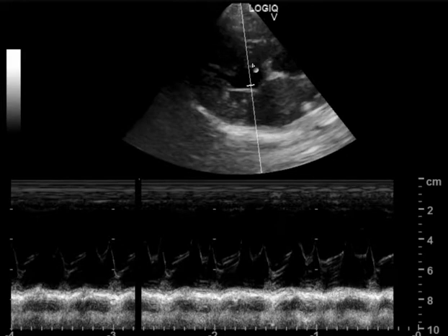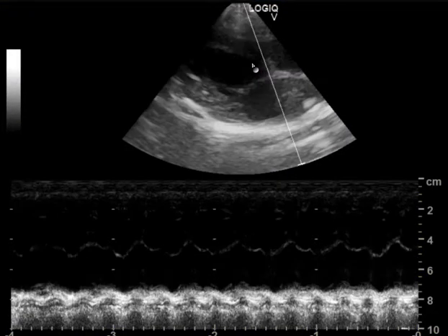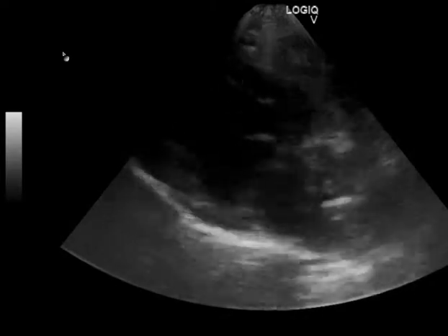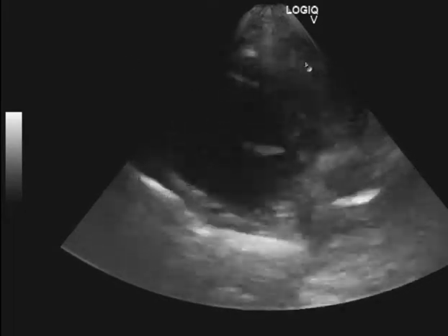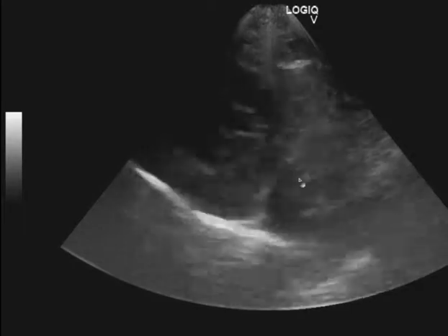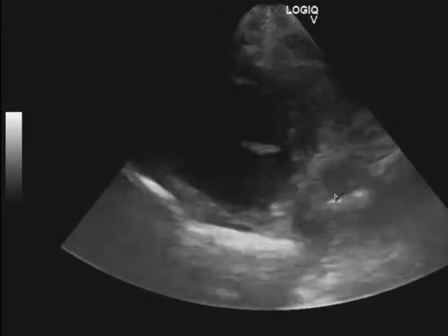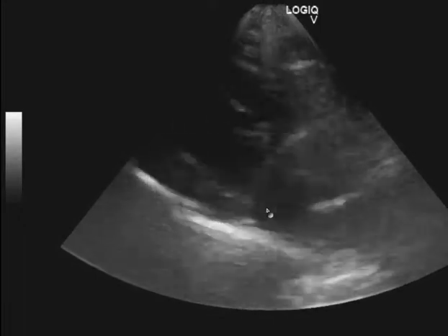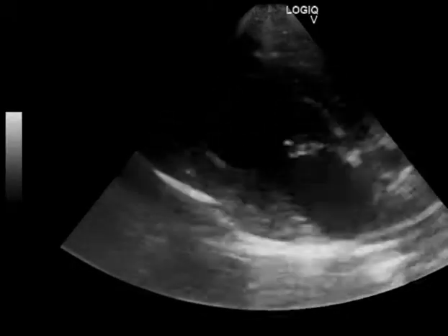You need to slide dorsally towards the spine and that will resolve that problem. Let's move over to the videos on your general assessment. I'm going to increase the gain a little bit here. Not a bad view here, but you have lung artifact in the way — you want to get that out of the way because it's obscuring your left atrium. Adjust a little bit more towards the sternum and this will come in a little bit cleaner. There you go — that's a better position.